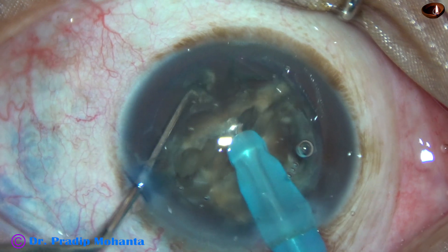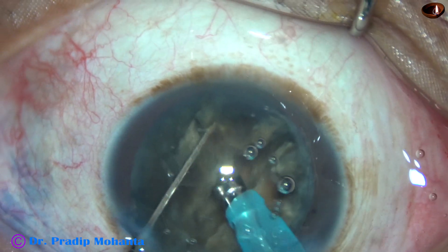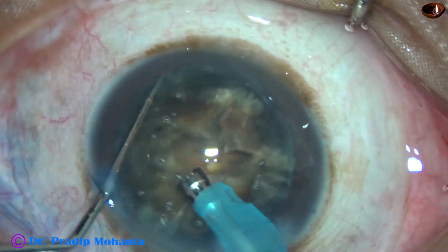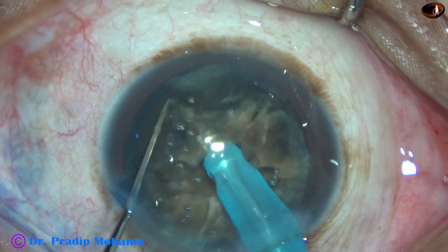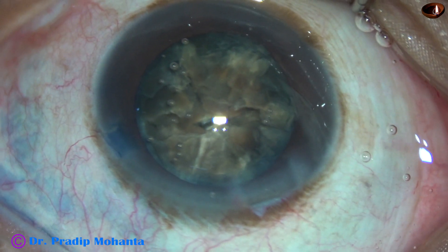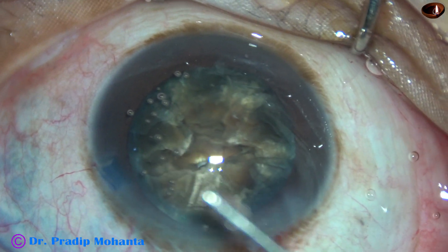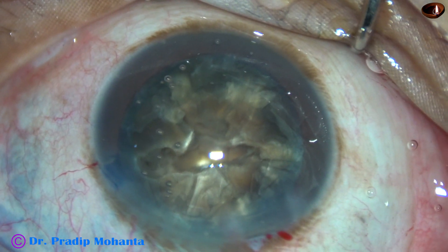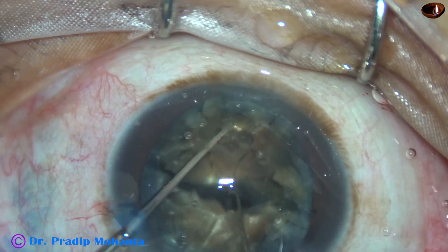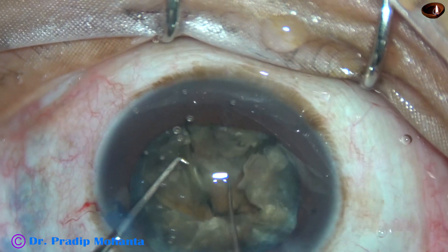This hemi-nucleus has been divided into 3. Now I come to the other hemi-nucleus — it is also being divided into 3 pieces. Some air bubble is still disturbing; I remove the air bubbles, engage the tip, go deep into the substance of the nucleus, and chop. I then use 2 Sinski hooks to separate the pieces, and all 3 pieces are now separate.